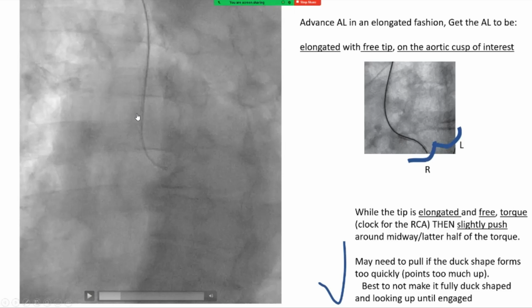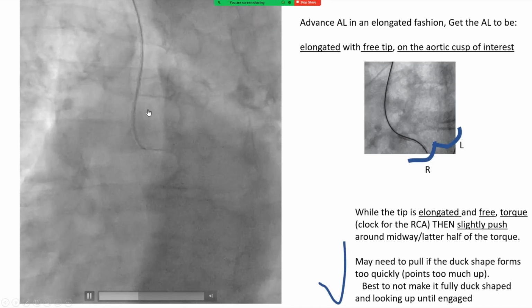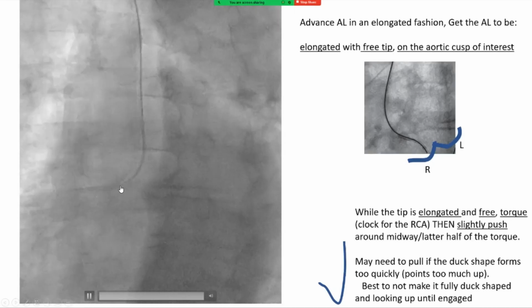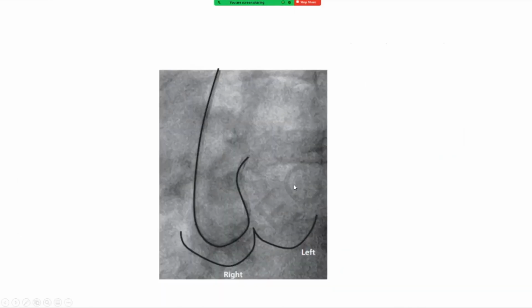This is an illustration of AL engagement of the RCA. So here we have an elongated Amplatz Left with a free tip, hooking the right cusp. We started clocking while it's free and elongated. Then toward the end, we pushed and engaged in a duck shape.